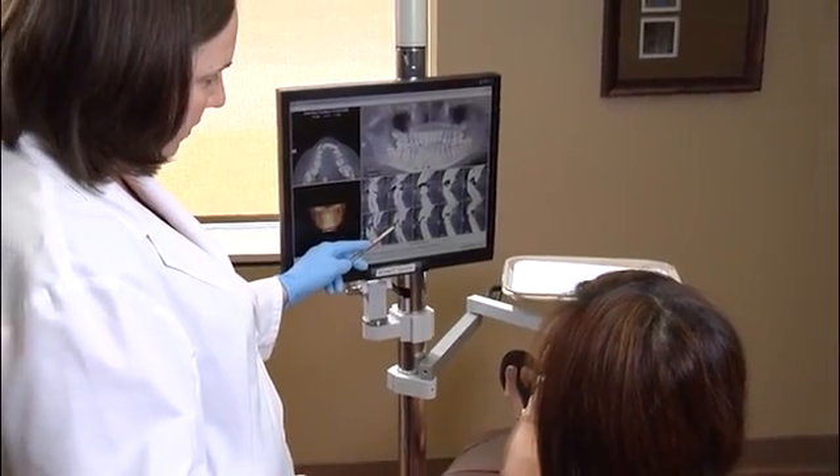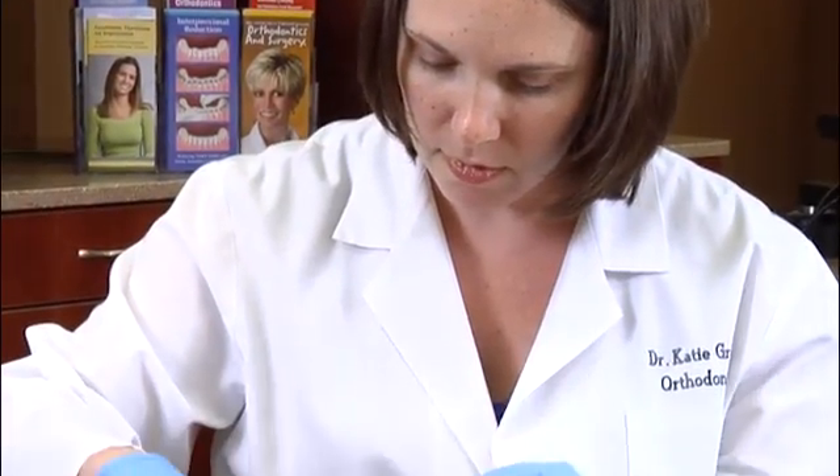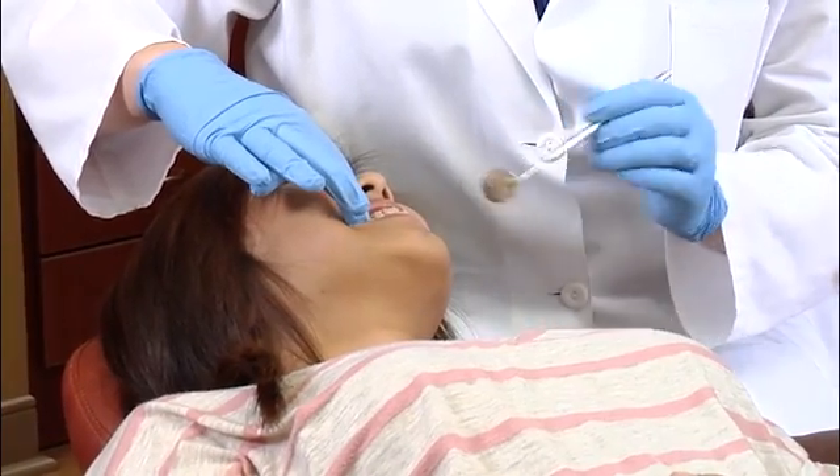The patient may return for orthodontic brace activations and use of the TAD almost immediately. Some patients have their TAD in for only a portion of their treatment — as little as six months — while for others, they have them in for the duration of their orthodontic care. When TADs are required for longer treatment periods, their positions may need to be changed. When the treatment is complete, commonly TADs can be removed with no anesthesia or with a topical numbing cream.